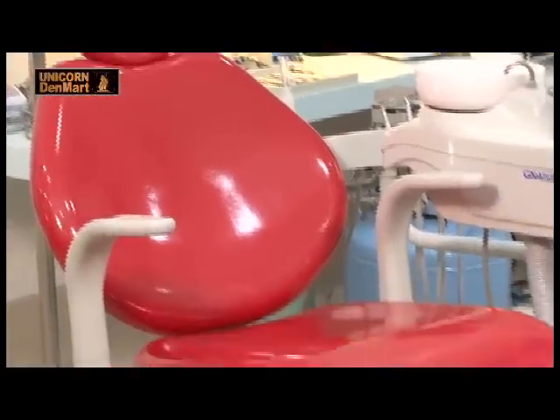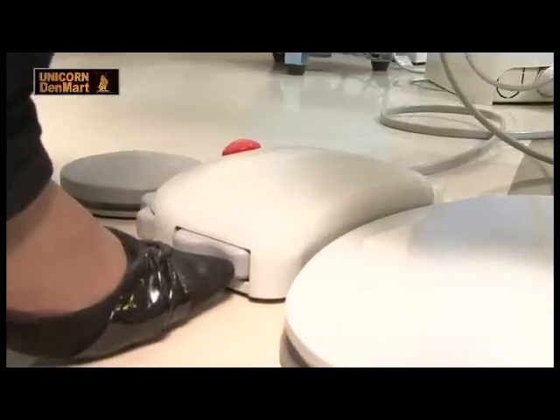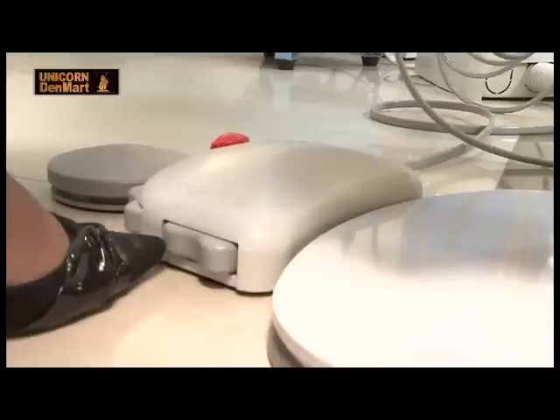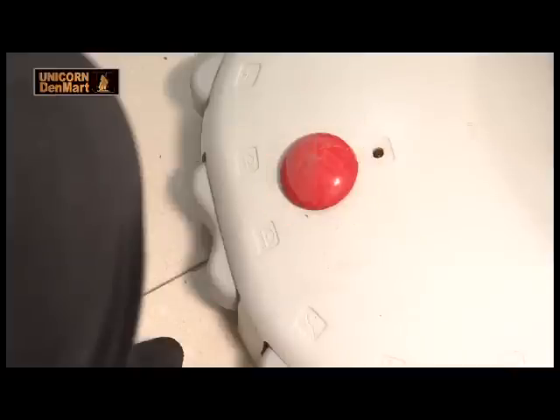For easy seating of the patient on and off the chair, it has a multi-functional foot control to control all movements of the chair along with the dental light. It has an emergency red lock to lock the chair if any obstruction occurs, preventing any unwanted movements and patient injuries during treatment.